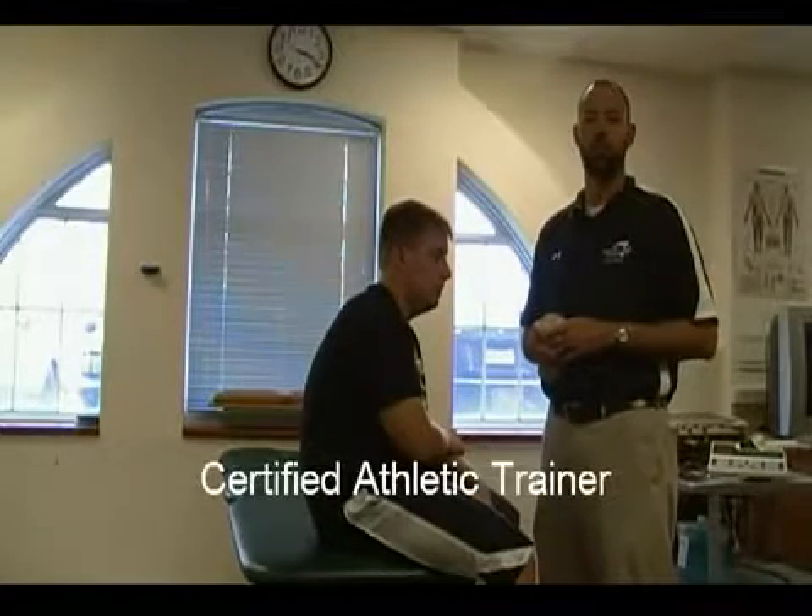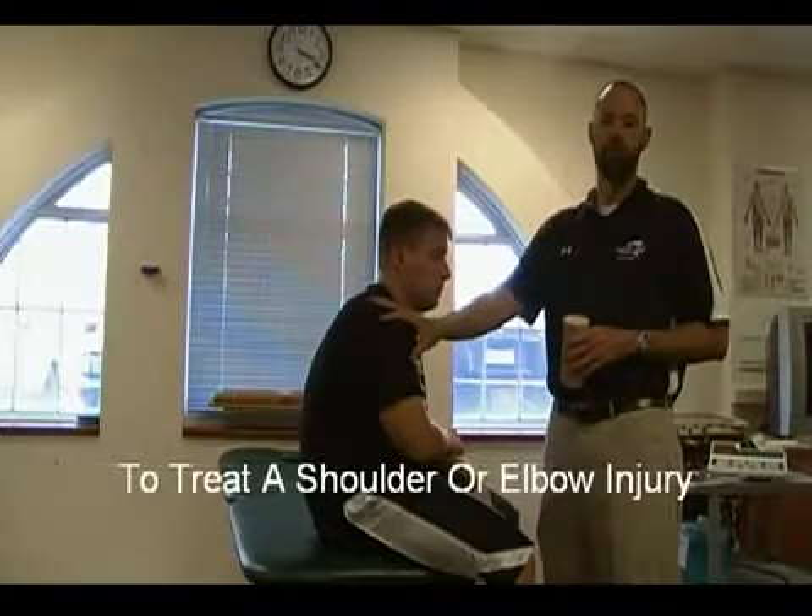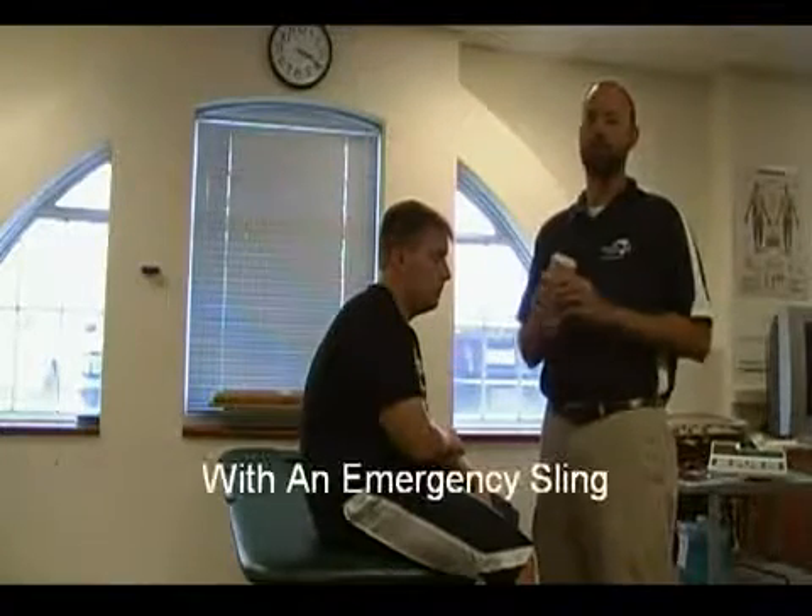Hi, I'm B.C. Charles Luskin, Associate Professor of Athletic Training at Greensboro College. Today I'll be demonstrating how to use a six-inch double-length elastic wrap in the treatment of a shoulder or an elbow injury in which I need to create a sling.